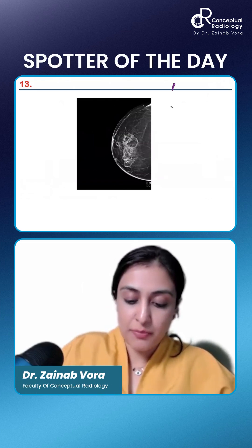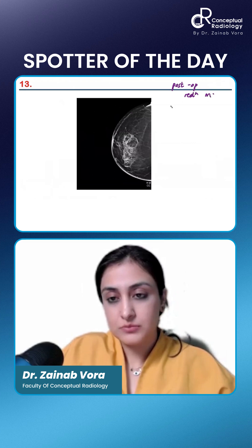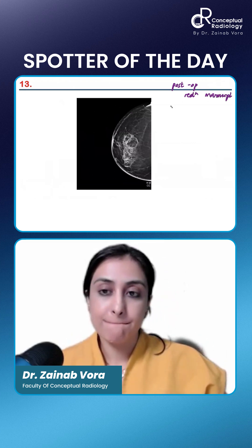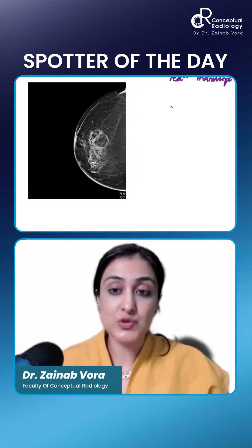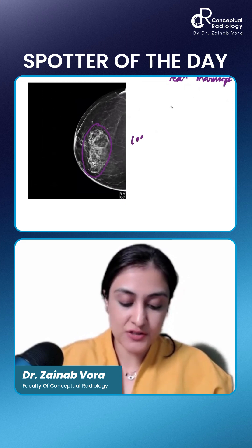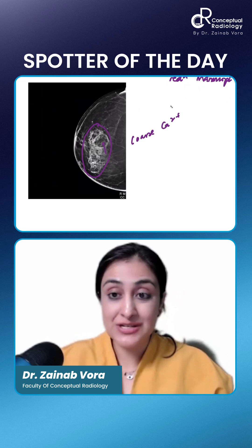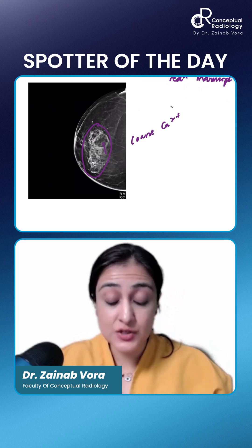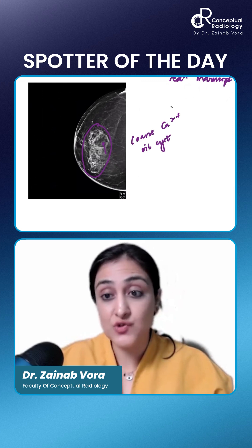This is a patient who's post-op reduction mammoplasty. When you see post-op status, what are you seeing here? You are seeing these multiple coarse calcifications, and you can see that there is fat density almost like an oil cyst. This is the classic appearance of an oil cyst, which is fat collected here.